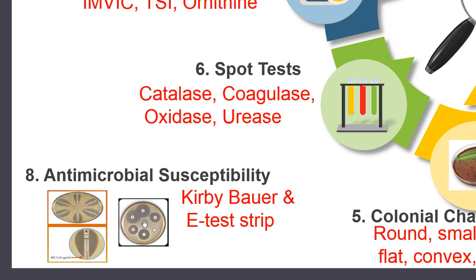Nowadays we also need to know the exact amount of antibiotic that is effective against one type of bacterial culture. For that purpose we need to know the minimal inhibitory concentration of the antibiotics, and that is why we are most commonly using the test strip method nowadays. These are basically nitrocellulose strips.